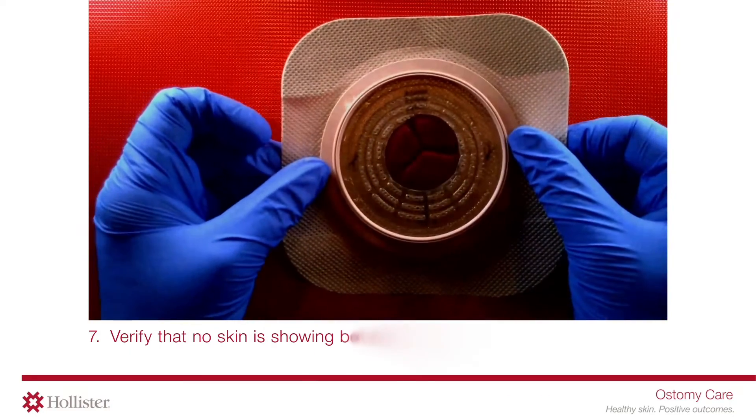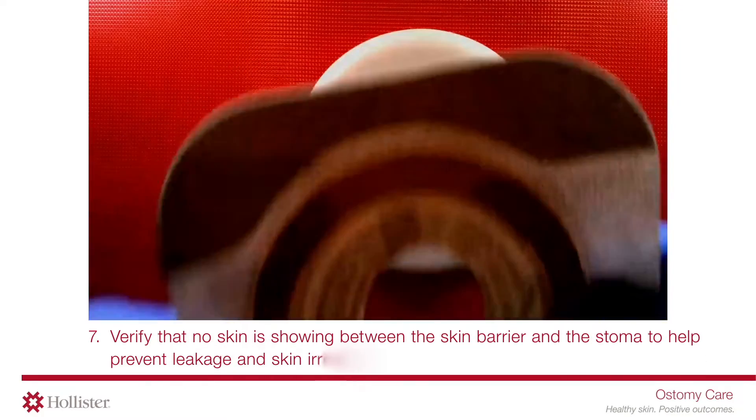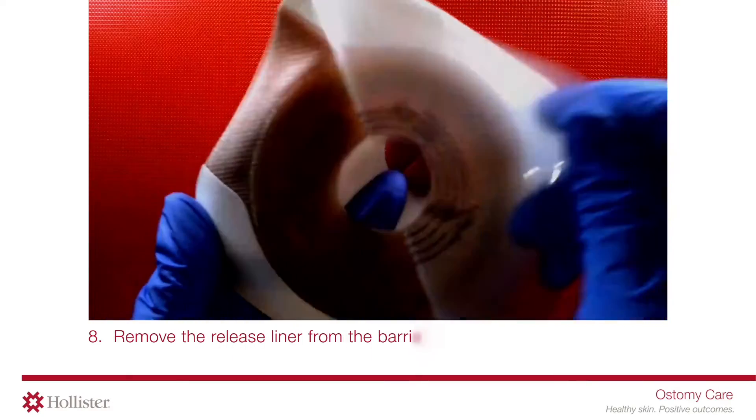Verify that no skin is showing between the skin barrier and the stoma to help prevent leakage and skin irritation. Remove the release liner from the barrier.